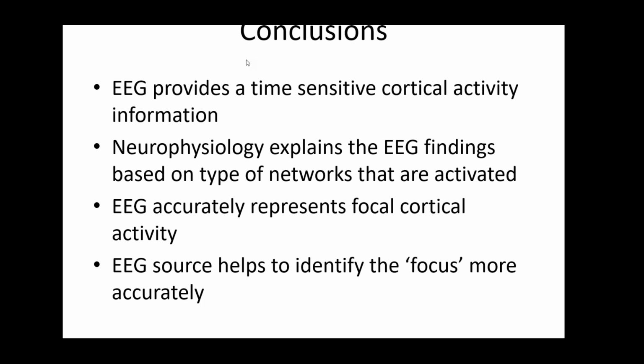So there are things that you could see with EEG analysis that could potentially be used for that. One of the techniques is biofeedback, where you could potentially use your EEG to help the patient improve the attention or the synchronization of multiple areas of the brain. But honestly, I don't know much about it, though I've read something about it that seems to be interesting and potentially useful.